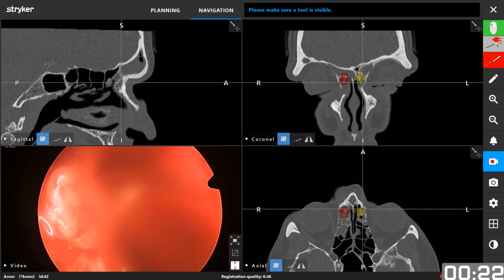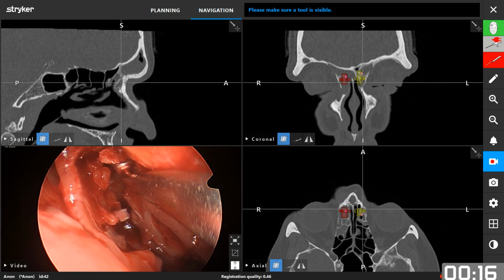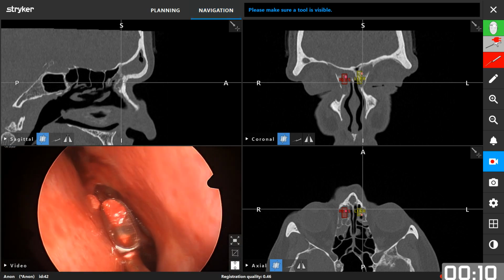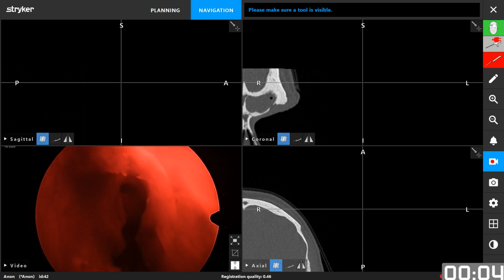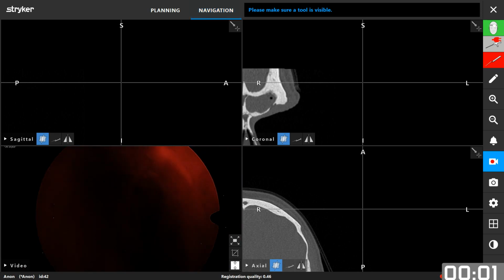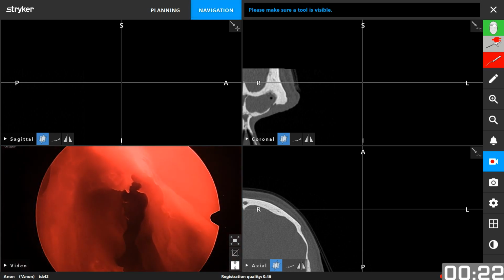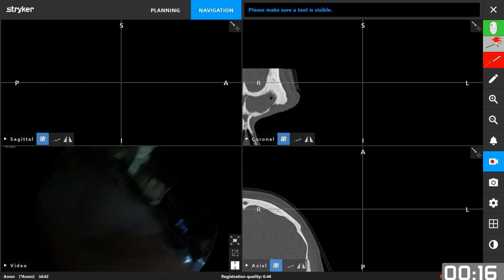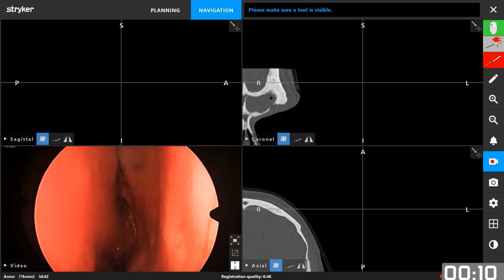Now, if I drill more, you can see this is the obvious skull base, which is bulging in front of you there. Removing more of the bone. Take one here. See how much bone there is. So what I'm trying to do now is some trans-illumination through the frontal sinus. And actually, as I said, this is illuminated inside this cell more than the frontal sinus itself.